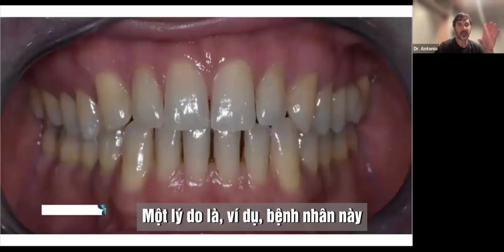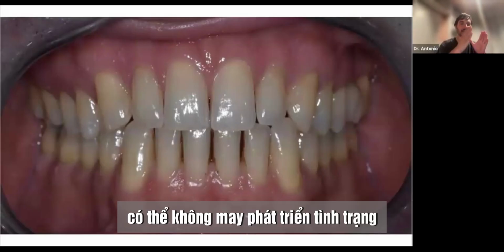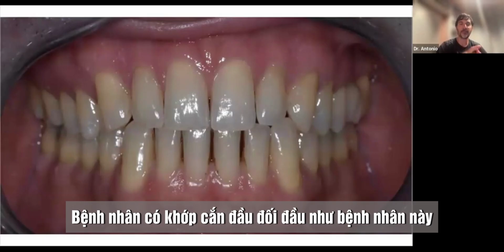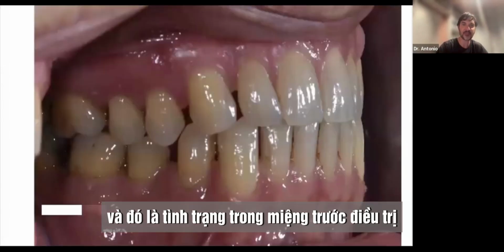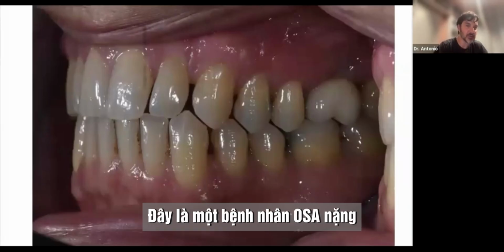One reason is, for example, that this patient is the typical OSAS patient that can develop, unfortunately, bad position of the teeth over the years. The edge-to-edge patient like this one, you can see here that we have a very little overjet, and that's the intraoral situation before treatment. It was a severe OSAS patient.